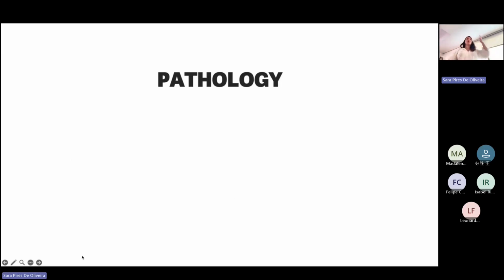That is, what is pathology. Basically, this is the study of thin sections of tissue that are collected from tumor samples. And then pathologists want to assess the morphological features, which they can use to identify the disease subtype, the progression of the tumor, and the severity. And this is super important for a detailed diagnosis and then the treatment management.